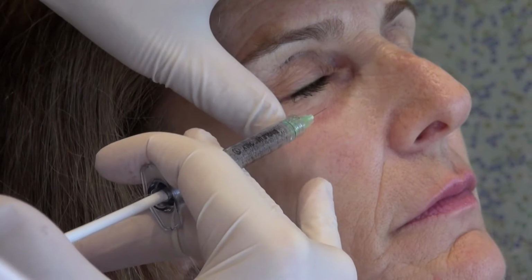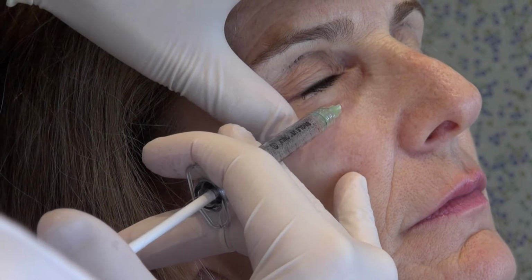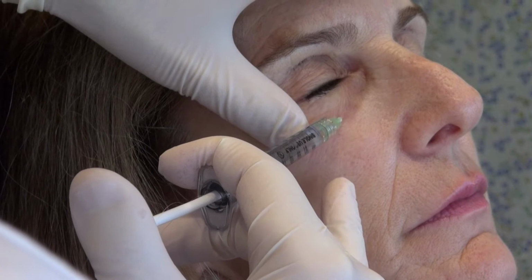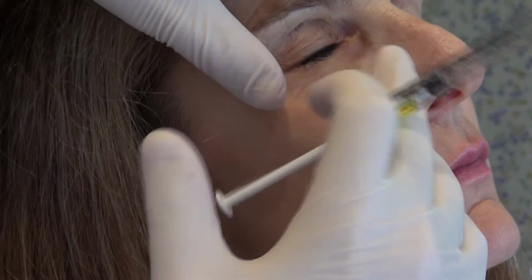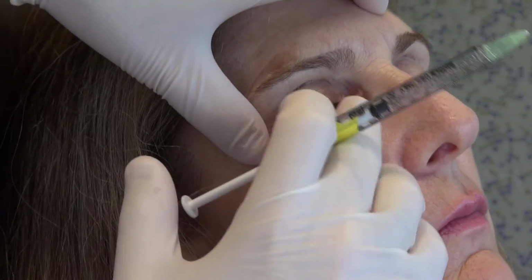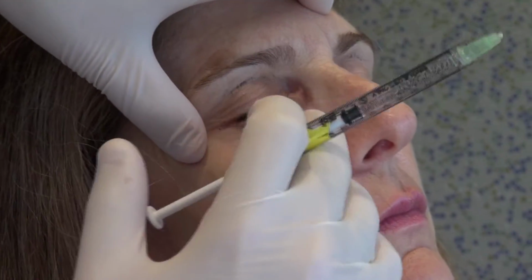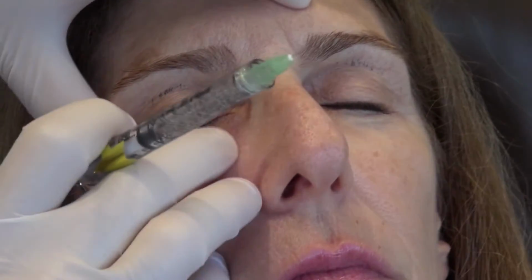When I'm injecting, my needle is never in one place. It's always moving. I find that to be one of the more reliable safety measures, and I like to call it universal injection precautions: whenever you inject, you're moving the needle. Because you can't see under the skin, you don't know exactly where that needle is. If the needle happens to be in an area you don't want it to be in, then at least you're in motion, and you're never going to deposit a large amount of material into an area that you don't want material to be in. Open your eyes.